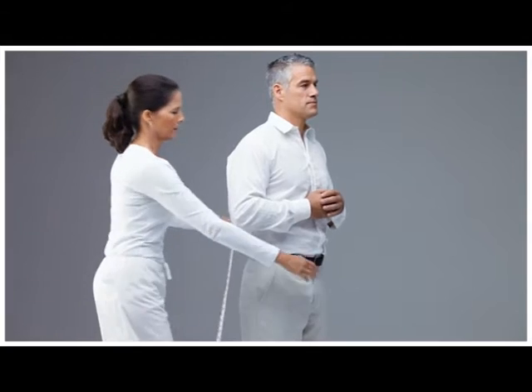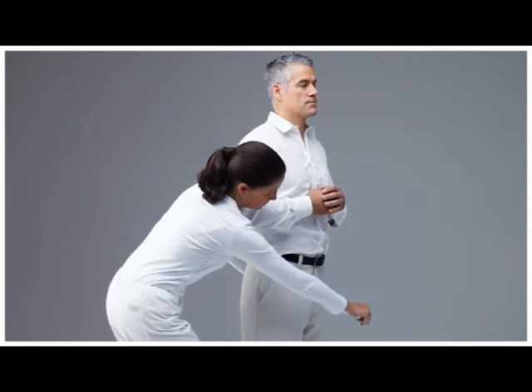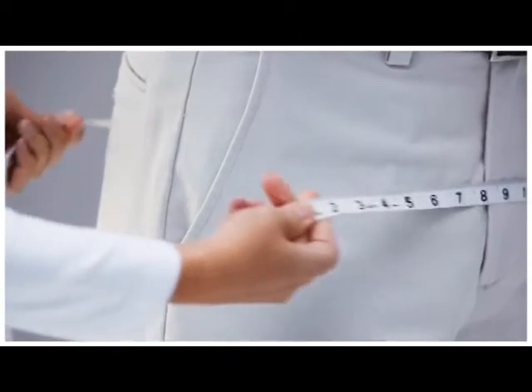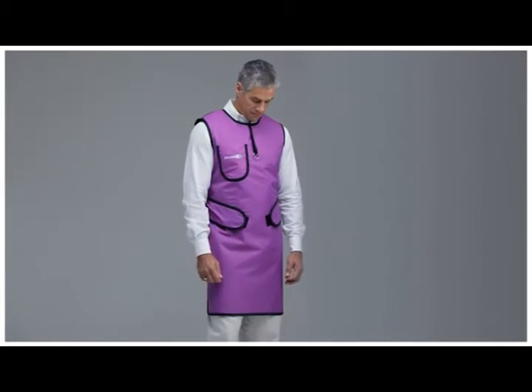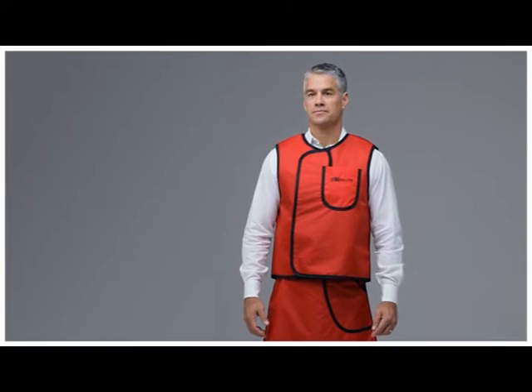Hip measurements are taken in the same manner as the waist. Measure around the fullest area of the hips. If possible, take the length measurements while wearing a similar apron to the one being ordered.